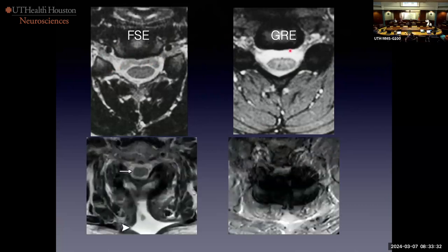When a patient has had posterior instrumented fusion, the GRE sequence is completely confounded by metal. Whereas the fast spin echo, because of the multiple 180s getting rid of magnetic field inhomogeneity again and again — making it more bulletproof — we can now see that there's a posterior fluid collection.